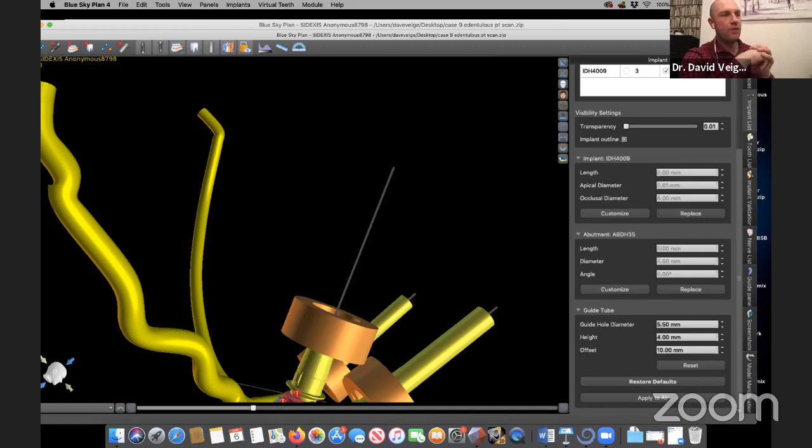And I've been playing around with different resins for the temporary prosthesis. I've forgotten, the first one I was using was GC temp resin.